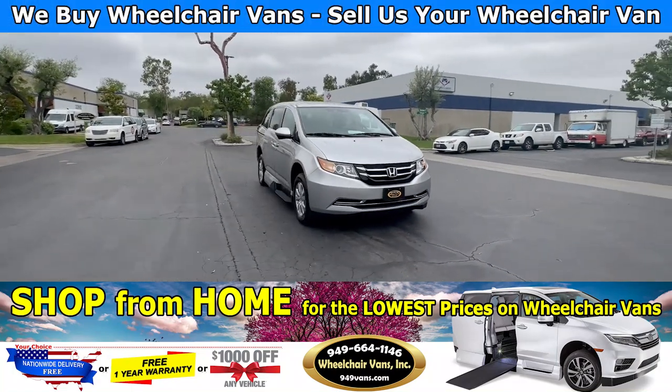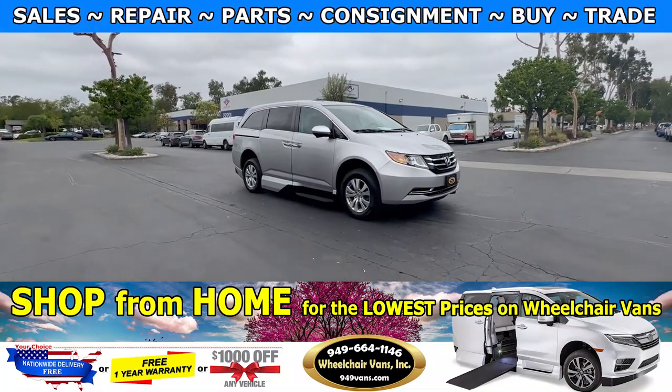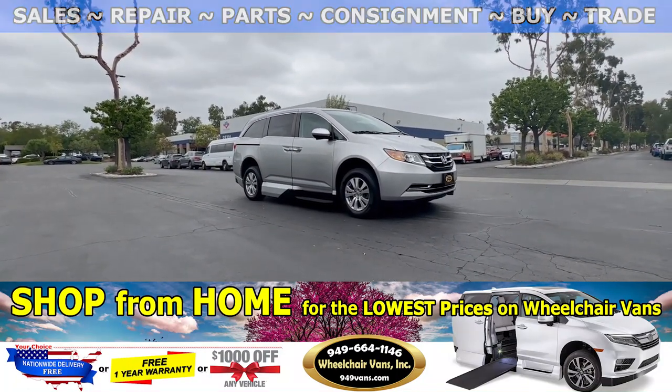Hello and welcome to Wheelchair Vans Inc. Today we will be going over a 2015 Honda Odyssey equipped with the VMI North Star.